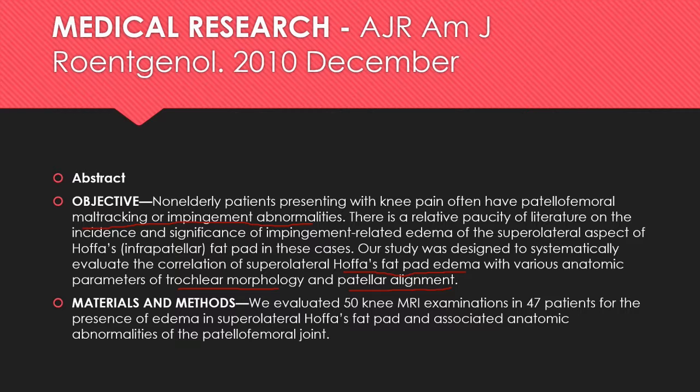So what they did is they evaluated 50 knee MRI examinations in 47 patients for the presence of edema in Hoffa's fat pad, and then they took those examinees who had edema in Hoffa's fat pad and they did assessments to assess for trochlear dysplasia and/or patella alta, which is known as an anatomic abnormality of the patellofemoral joint. Okay, so what did they find?